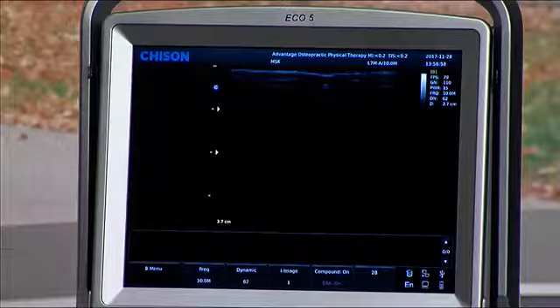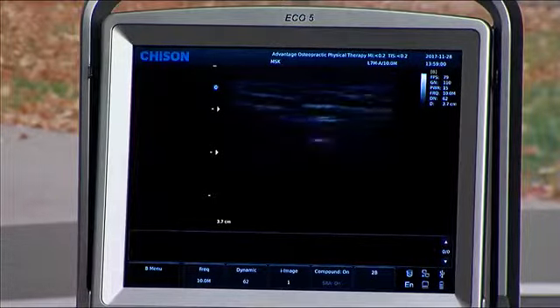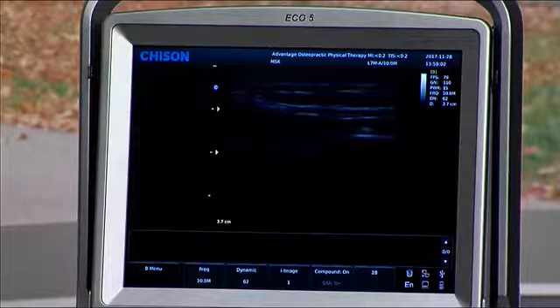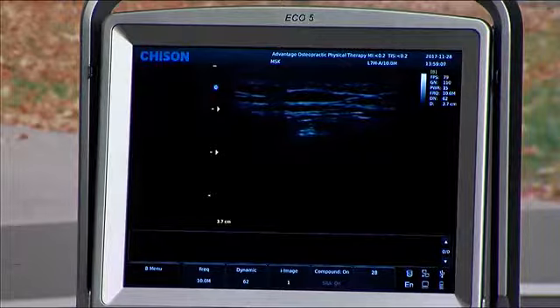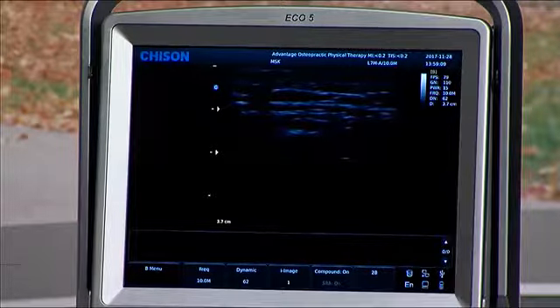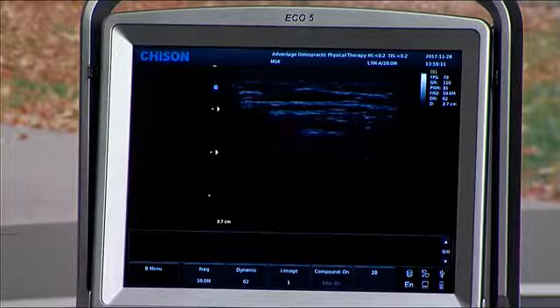Thank you. Okay, I want to understand, having this system in your office, why? Well, it's an excellent tool to help us see exactly what's going on real time in vivo as we're looking at things. So if we're looking at your shoulder or anything, I'll jump up on the screen. What you should see, it's hard to see through the camera. But what we can see is we can look down in there and see what's going on with the muscles at the time. So if we're suspecting that there's a rotator cuff issue or something like that. And that's what we're seeing on the screen now.